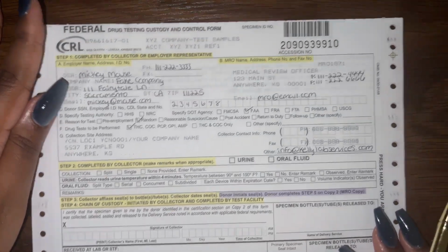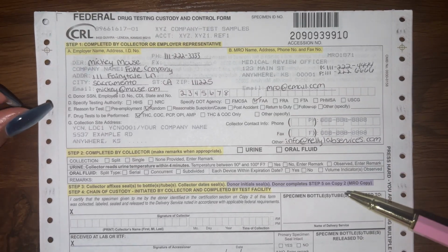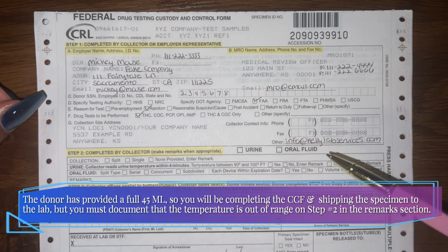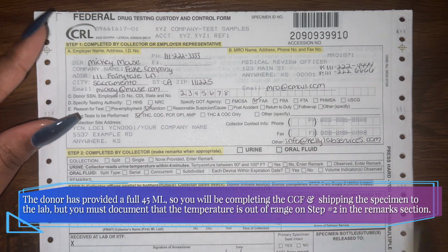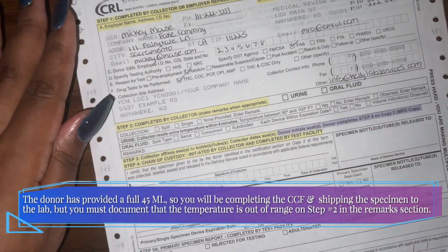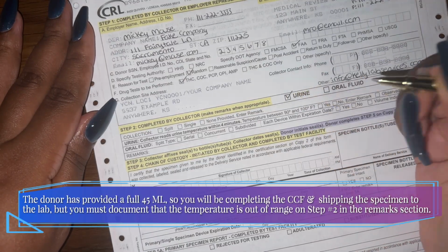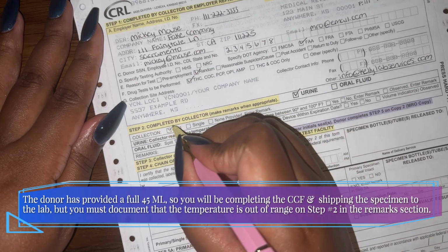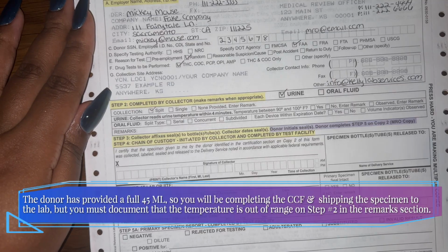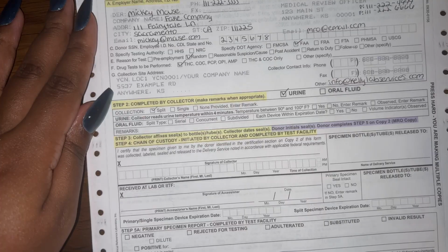Please keep in mind, this is your first CCF form, and this form is going to have the documentation about the specimen having a temperature that is out of range. So that is what we're documenting on this first CCF form. So please keep that in mind. So we're going to always check the box that says urine, because this is a urine screen. It is split because we're going to split the 45 mLs between 30 and 15 milliliters, because we are going to send this specimen to the lab even though it was out of the temperature range.